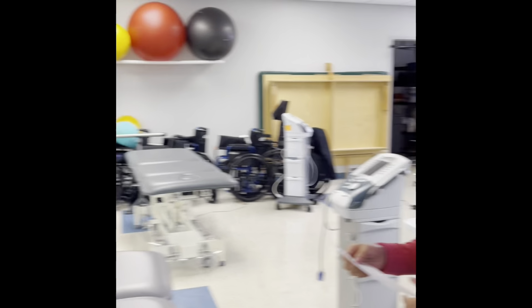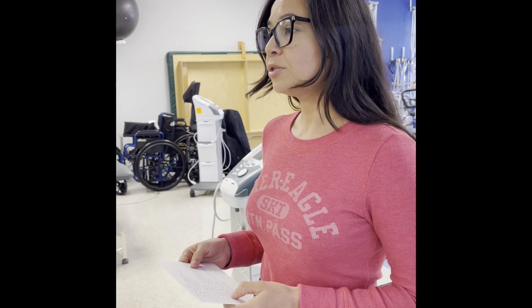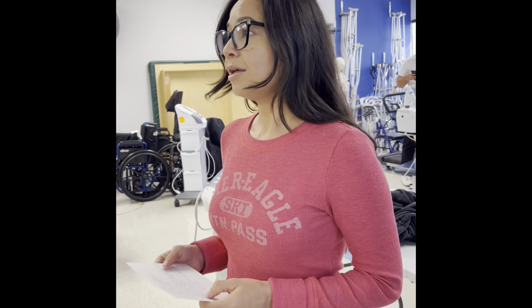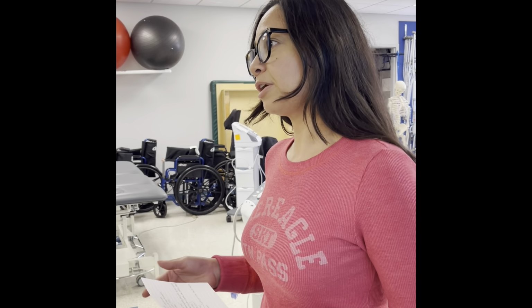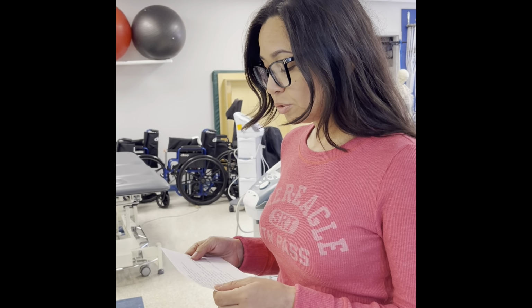Well, I read that you're having some muscle spasms in your lower back, so we're going to use traction to help you with that. Are you okay with that? First of all, we're going to go through some contraindications and precautions to see if you are qualified for traction. Okay. So, had you been instructed not to move your back?